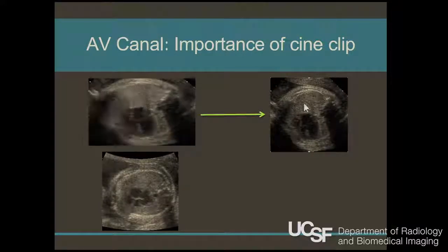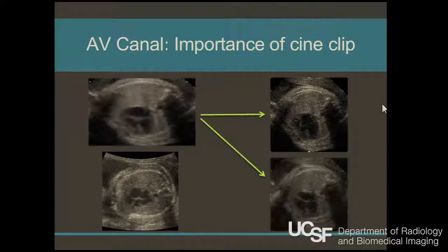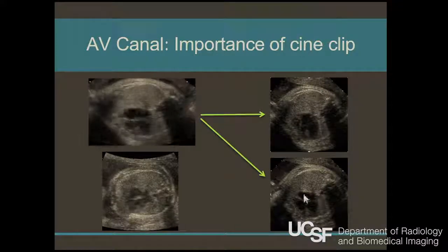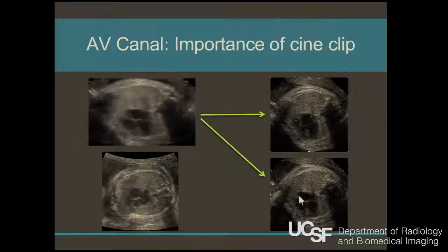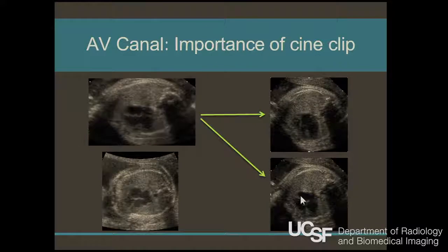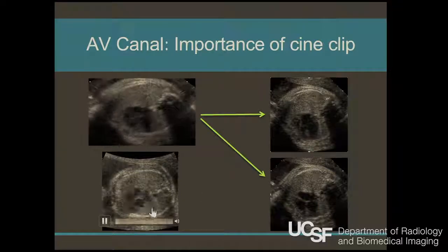It's just this amorphous hypoechoic structure in the middle of the chest. If you freeze it when that valve is closed, you could actually decide that's a relatively normal 4-chamber view. They all have kind of a patent foramen ovale, so oftentimes you don't see a real good ASD here. So I could see how that might make someone think that's a normal heart.